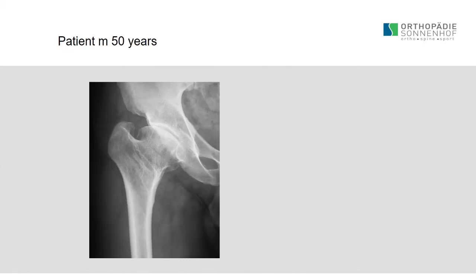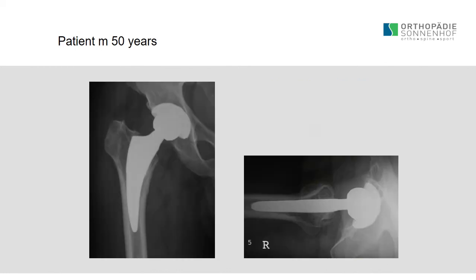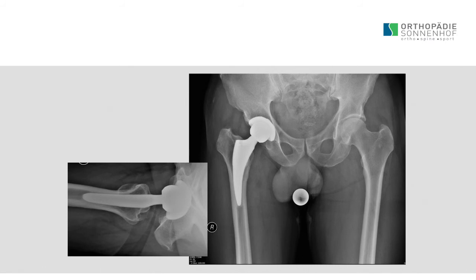Sometimes you have to adapt for antetorsion, retrotorsion, and in these cases it may be helpful to have a short stem which allows you to have rotational possibilities for adaptation, because it's not over defined, especially in the posterior direction, so you can do the adaptation. This is also a case 10 years down the road. It looks also nicely, as I would think.